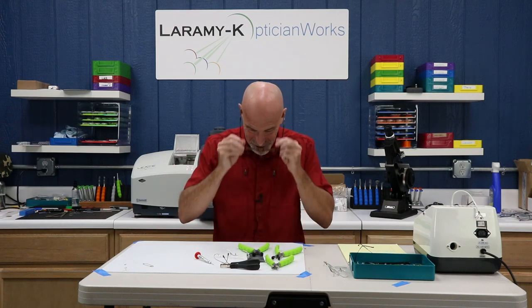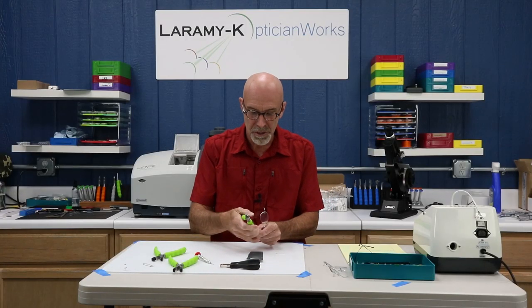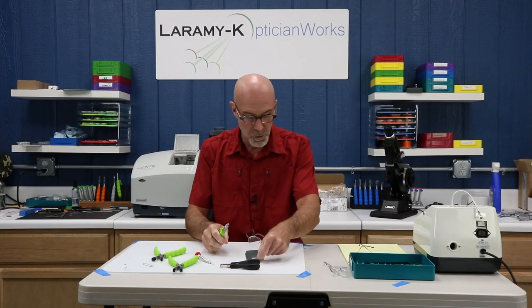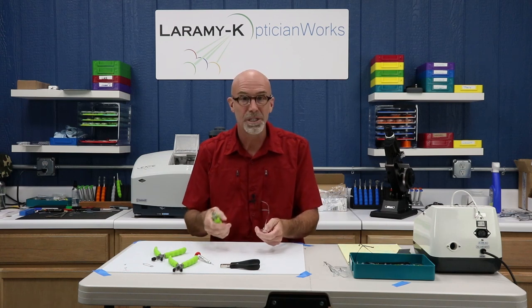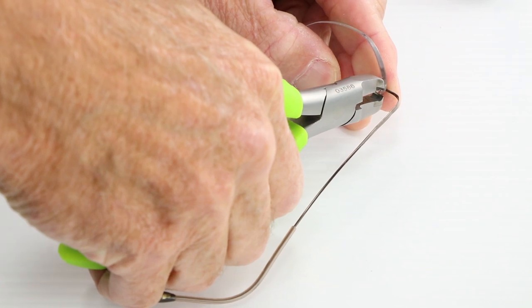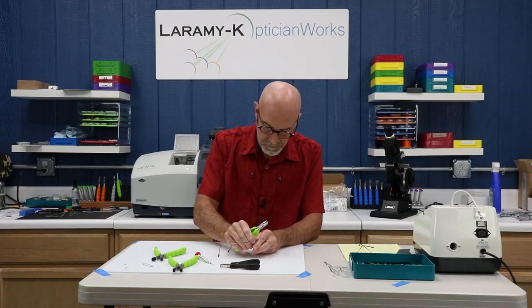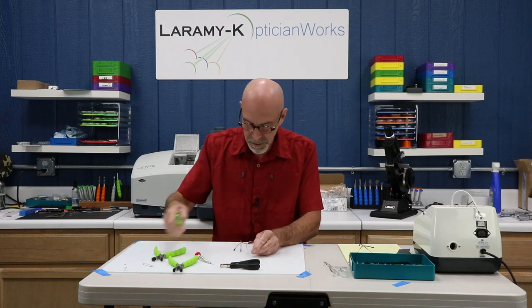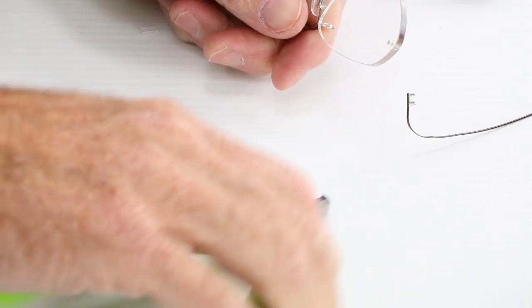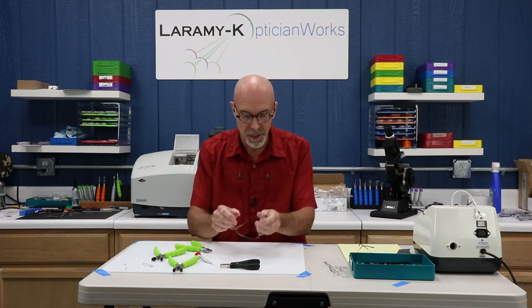Let's take this thing apart and put it back together again. I'm going to take my good clippers — the ones that are perfectly smooth — because I don't want to risk damaging this lens, and I'm going to trim away the bushing on the back. Step one is done; I've trimmed off the backside of the bushing.